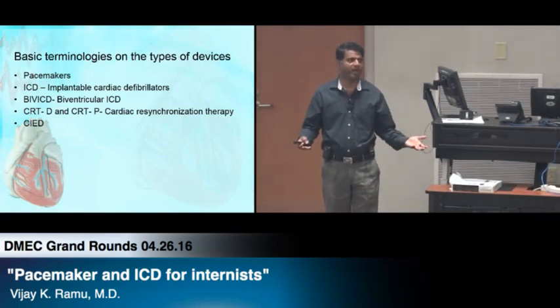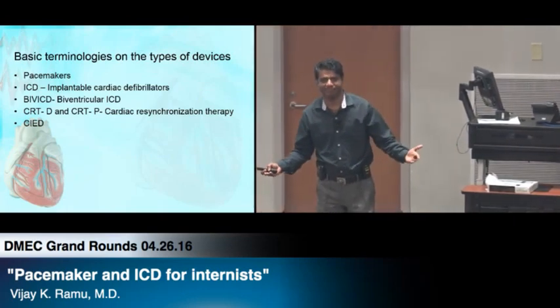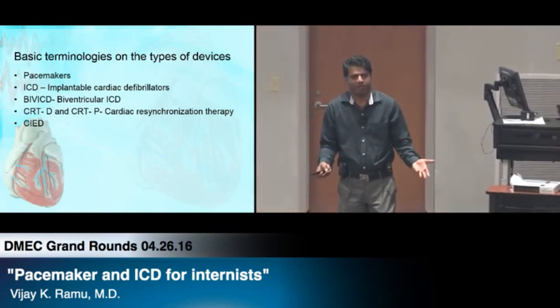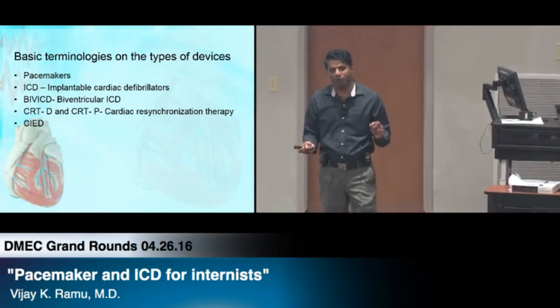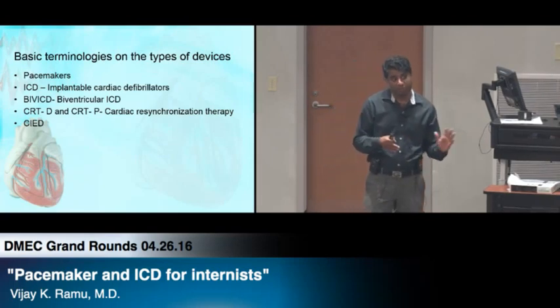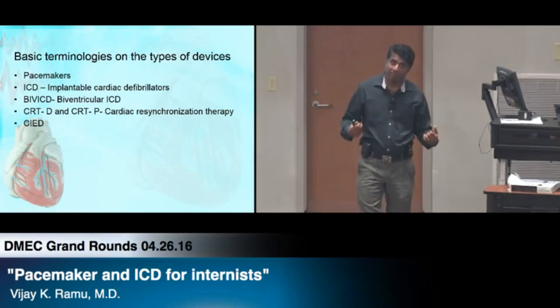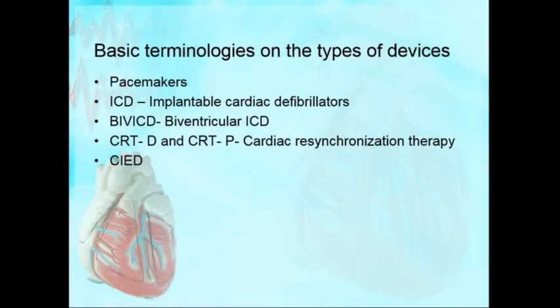So the question was implantable cardiac defibrillator. The question was, what's the other kind? That was the question, right? Implantable, everybody gets an ICD. You should have just called it cardiac defibrillator. Why do you call it an implantable cardiac defibrillator? The reason now it makes even more sense is there is an external defibrillator version, what you guys are familiar with, LifeVest. How many of you have seen it, or heard about it?